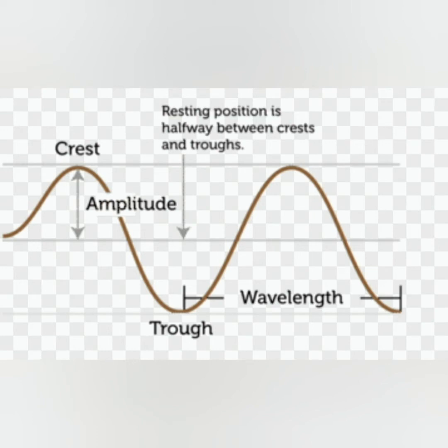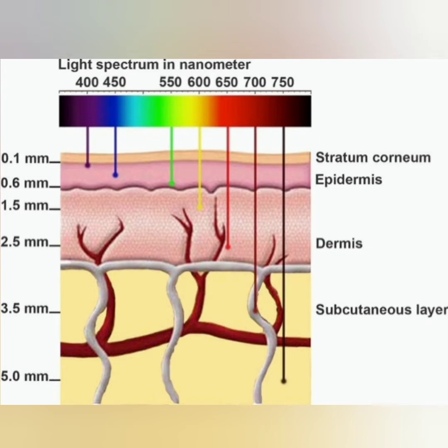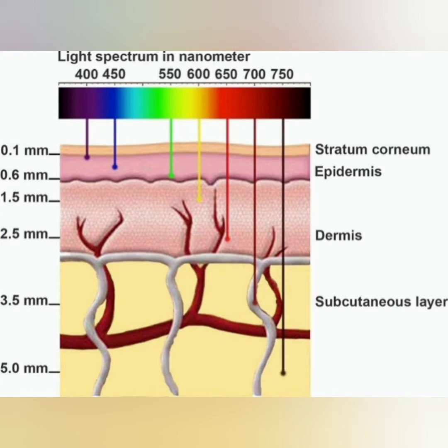In lasers, as I told you, longer wavelengths penetrate deeper into the target. So longer wavelengths are used to treat deeper targets and to avoid and protect superficial parts of the skin. Shorter wavelengths, in contrast, are used to treat more superficial targets and avoid damaging deeper skin parts. This capability allows the experienced pulse light physician to vary the light delivered in order to match the depth of the target and avoid the areas which are not to be treated.